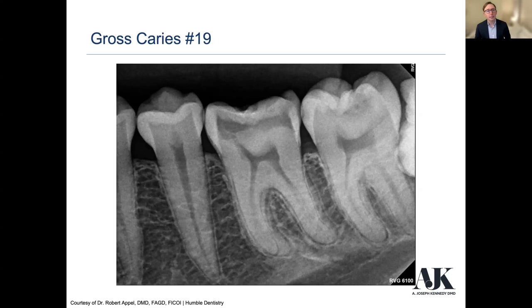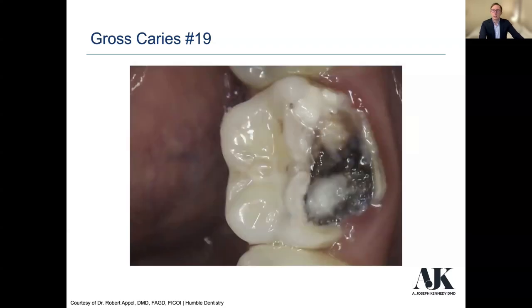Well, you may be right. But let's say this patient here, we'll call him John, doesn't have the finances to afford that 2740 crown. What can we do that's maybe a step up from a PMMA and just something that may be a little bit more definitive for them as they work to maybe find that money or can come back in a few years and get that definitive crown, or just see how this one lasts because we know that the marginal integrity is pretty solid. So this is what it looks like clinically.